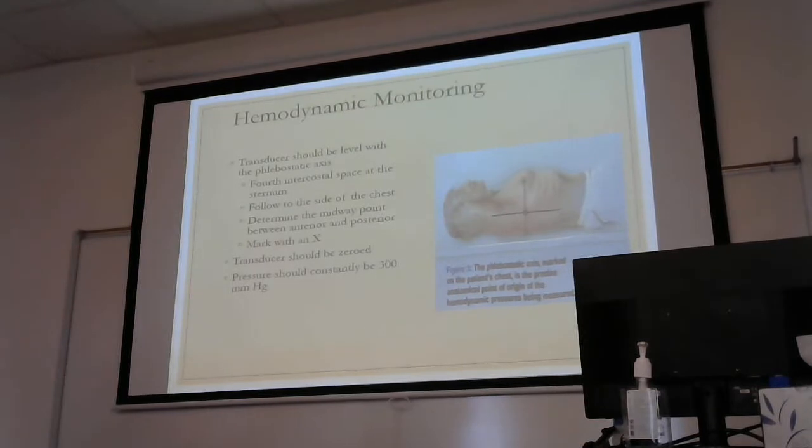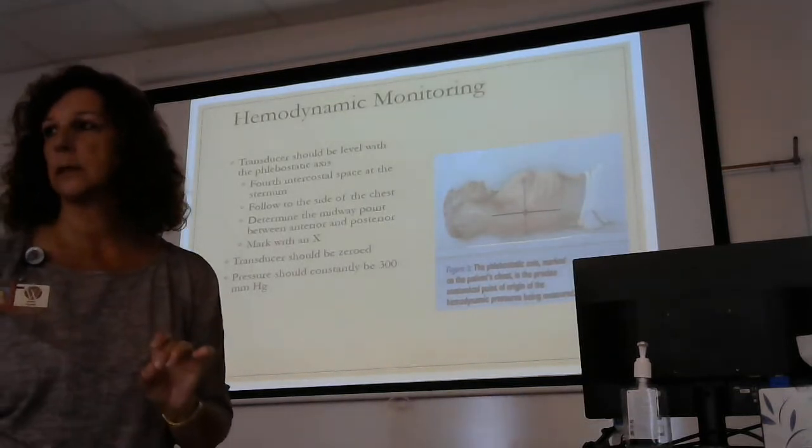Sterile dressing change. To maintain the bag at how many millimeters of mercury? I need to make sure that I have what on my monitor? Corresponding appropriate waveform. We're going to talk about the differences in waveforms. And now this is my third and big responsibility, that it has been zeroed and calibrated at the phlebostatic axis.